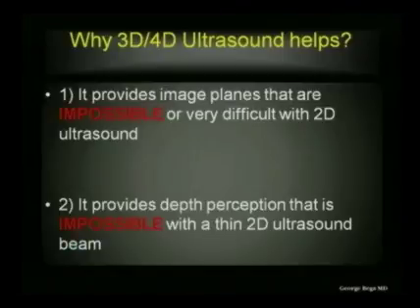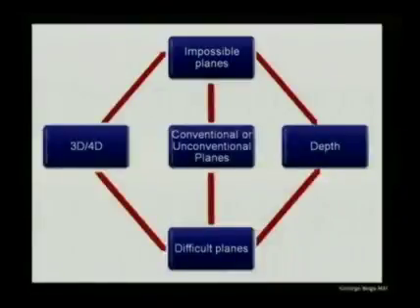The second reason why we need to do a 3D ultrasound in clinical practice is it may provide for us depth. Depth is something that we simply cannot obtain with 2D ultrasound. The reason for this is very simple. 2D ultrasound scans with a thin 2D beam.